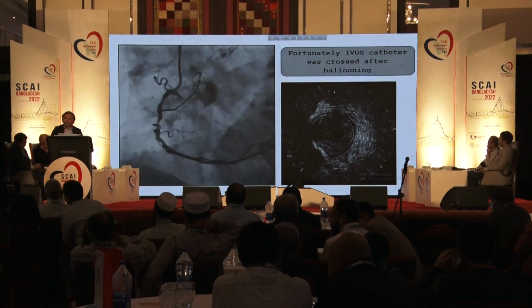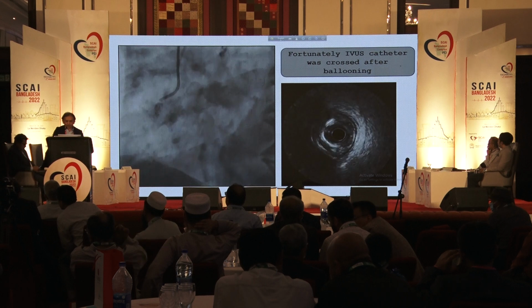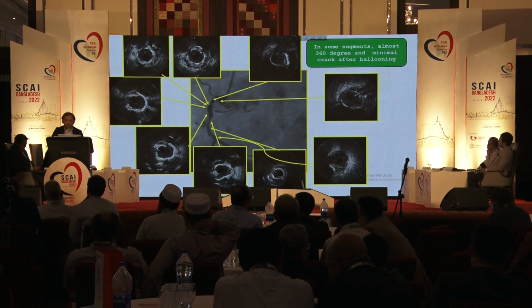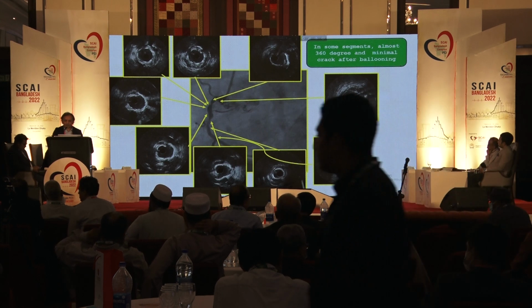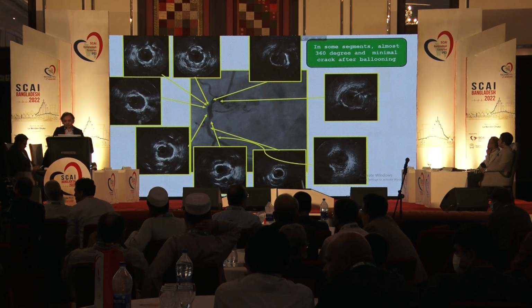So fortunately, the IVUS catheter was crossed after ballooning, and then IVUS is showing this freeze picture. You can see in some places the stents are not apposed at all. In some segments, almost 360 degree calcium and minimal crack after ballooning.